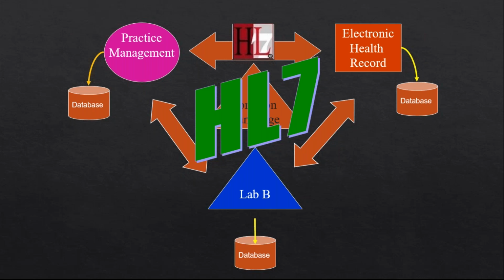They just need to understand the HL7 message, and once they understand it, they can easily interpret it. Similar to the scenario that we discussed, where if the other person understands English, then that's well and fine. He doesn't need to go ahead and learn the other guy's language. In a similar way, the applications do not need to understand each other's database architecture. They just need to understand the HL7 language.